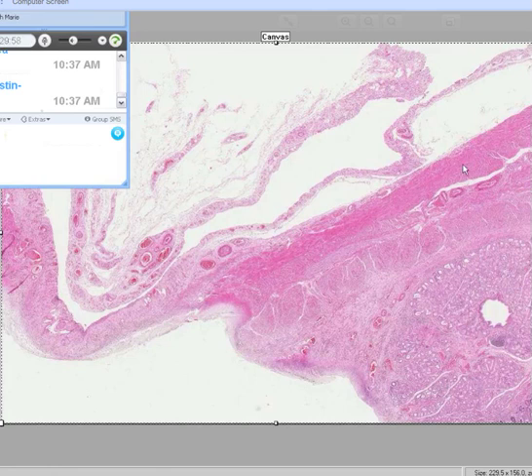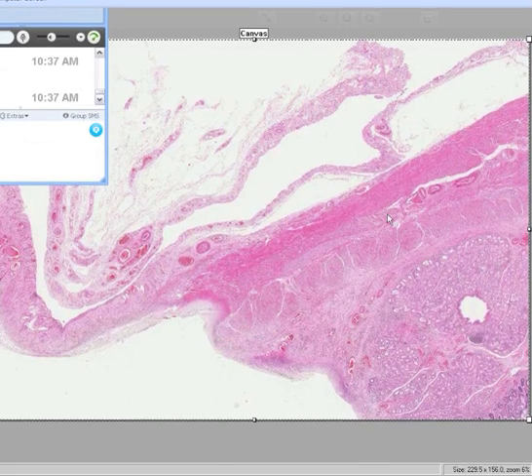I think you could see some loose connective tissue that's outside the smooth muscle. I think you could see a pretty good little band of pretty uniform smooth muscle here. Here's the longitudinal layer. Here's the circular layer. And then you see a bunch of normal looking glands in the submucosa.